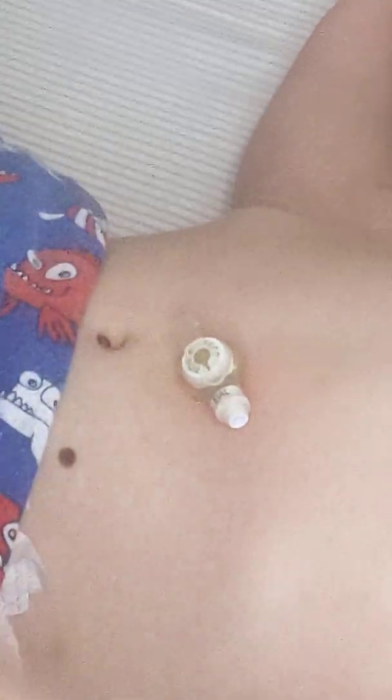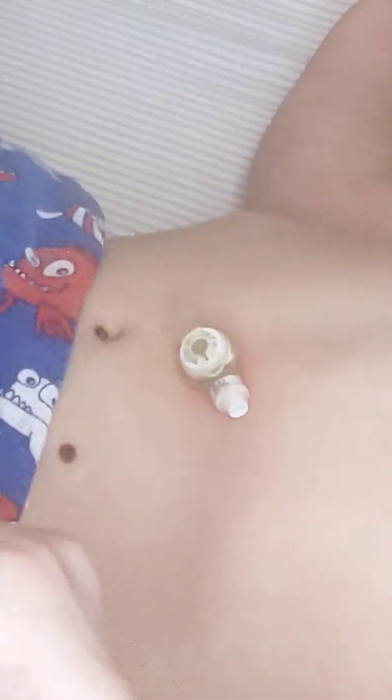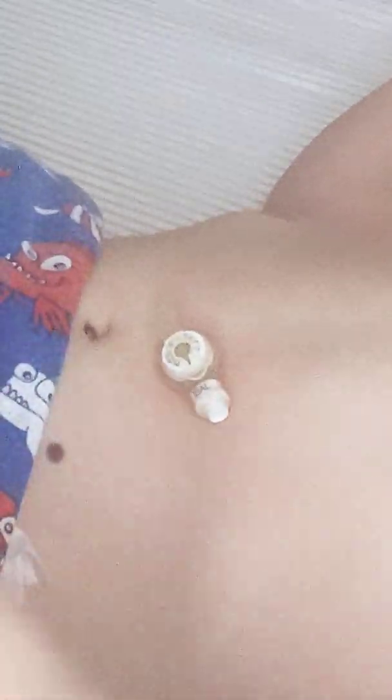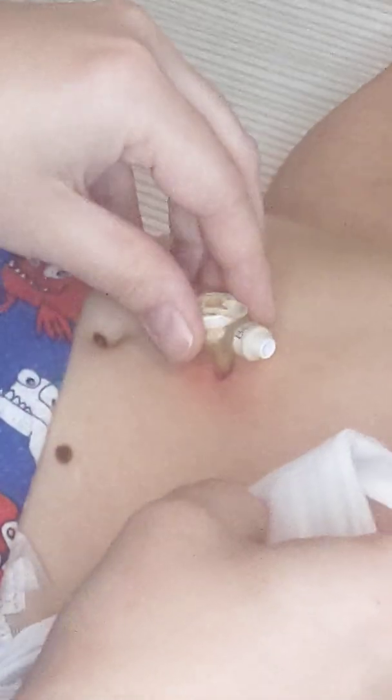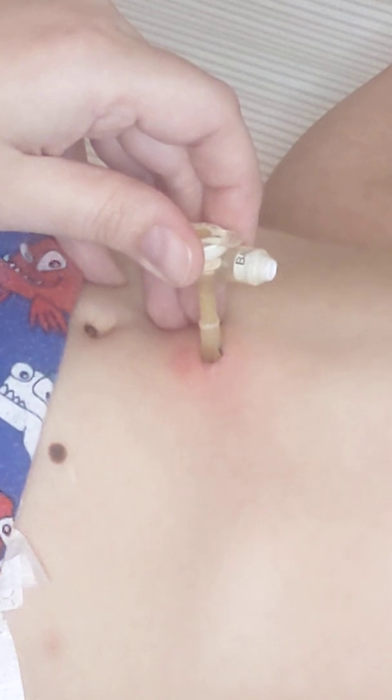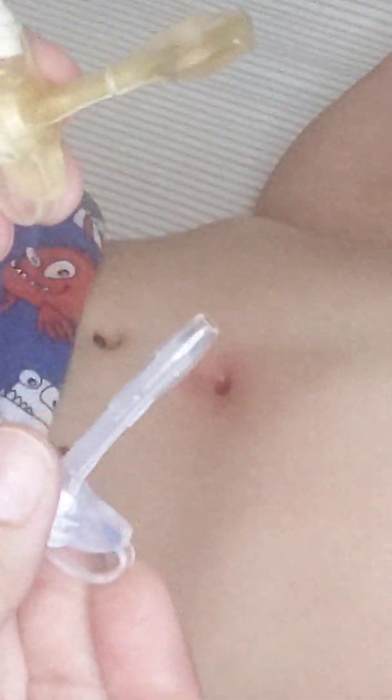The next thing you should do is have your button ready to go, and whatever lubrication you're going to use. I'm going to put a little bit on my finger, because once I pull this out, I'm going to grab the gauze too. Once I pull this out, it's going to look a little scary, and it might even be a little hard to tug out, but that's okay. You'll see that he has the hole there. That's okay. Just make sure you're cleaning it. Then I'm going to put a little bit of chapstick around that area, to help the new button in. So you can see the difference here. Old button, new button. That's perfectly normal, I was told.